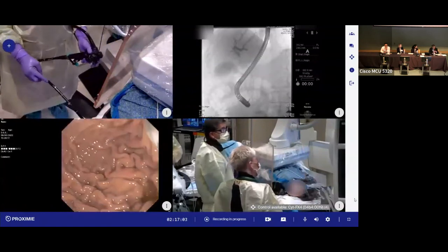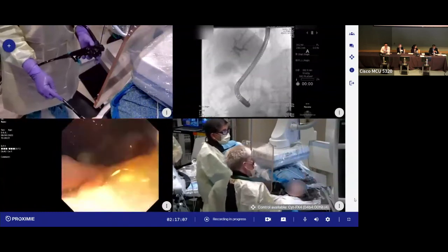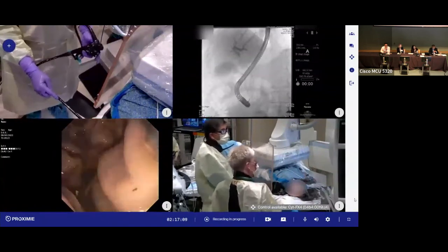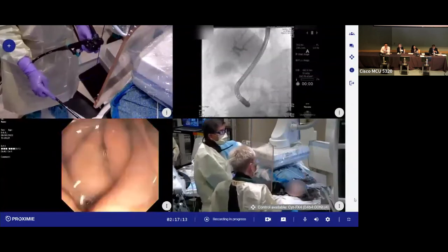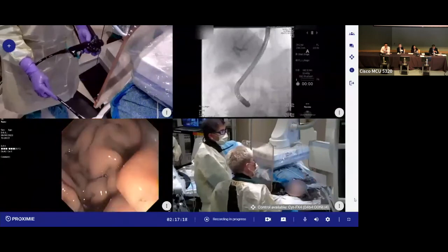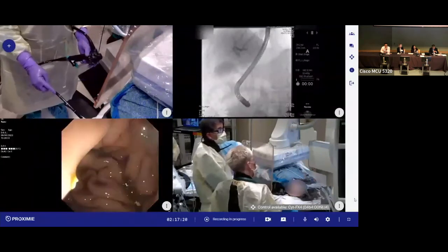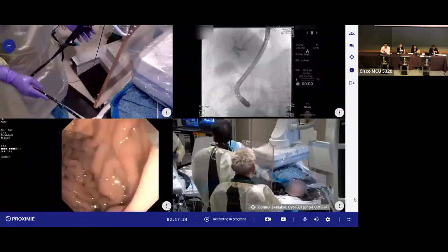But if the covered metal stent is the only strategy, I don't think it's a good strategy. But if it's going to ease your treatment, resolve a stricture, or you're prepared to then do cholangioscopy at the next procedure, then it's fine. But a double pigtail stent or a straight stent would work too. Jeff, I'd love to hear your comments about that.